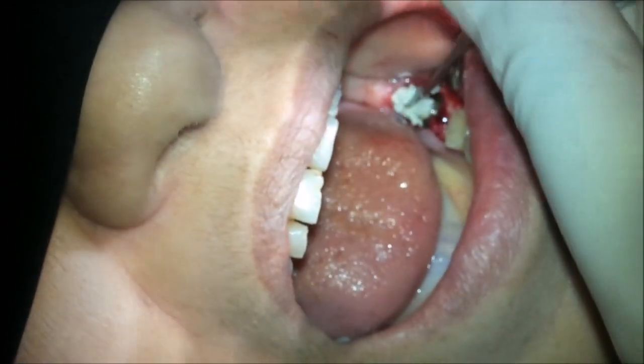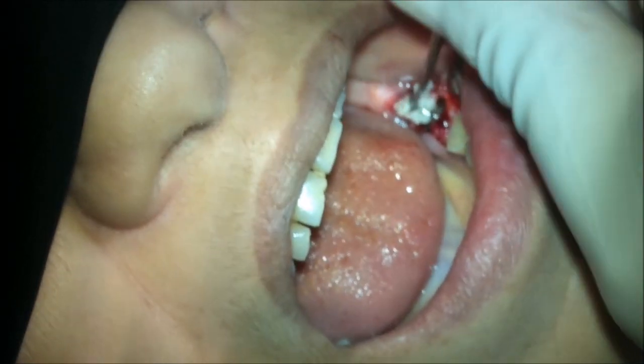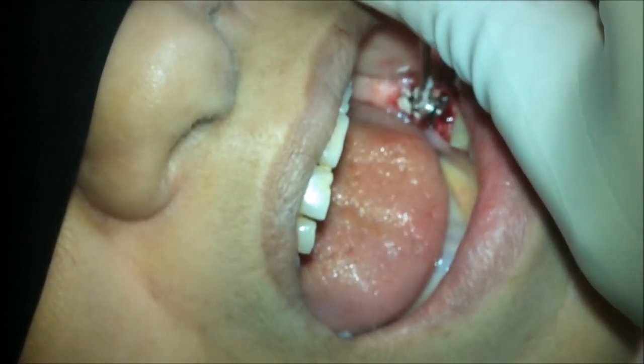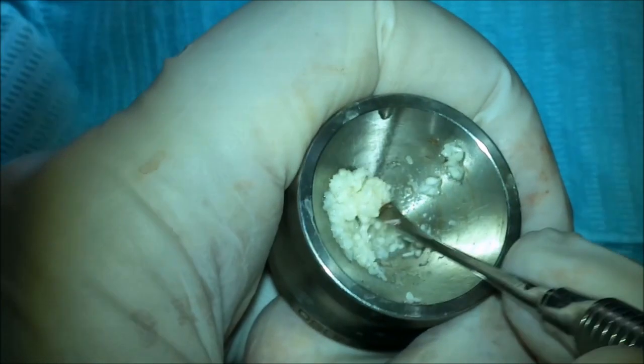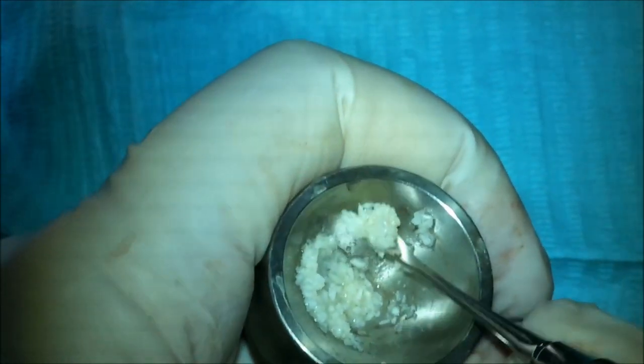I always prefer to put the cover screw before inserting the bone graft in place. After that, we can remove the cover screw and use it for fixation of the membrane.